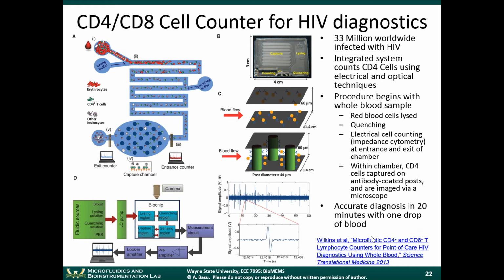So the next example is of an integrated system. This is another example where the portability of the microfluidic device makes it useful. This is a cell counter for HIV diagnostics.